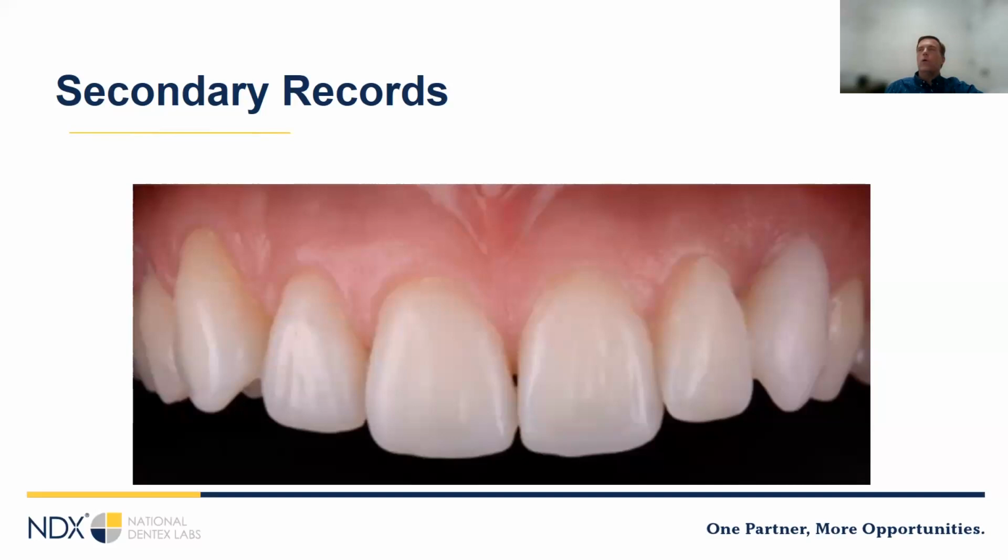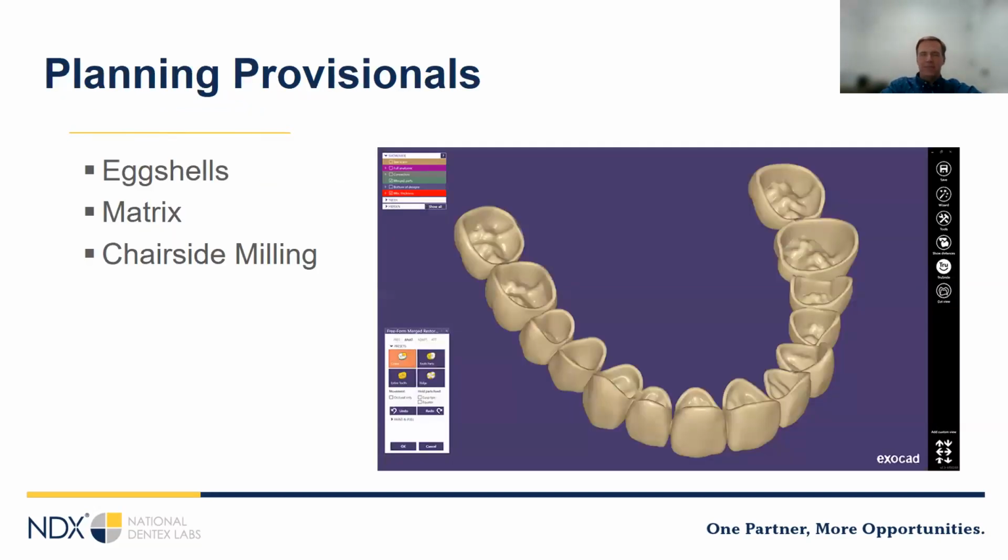So at this point, everything else we do, we're going to be trying to preserve our tooth position and occlusal scheme as we're moving forward. We're not trying to reinvent the wheel. We already have a good wheel. We just want to put the right car on it, I guess, using that analogy.